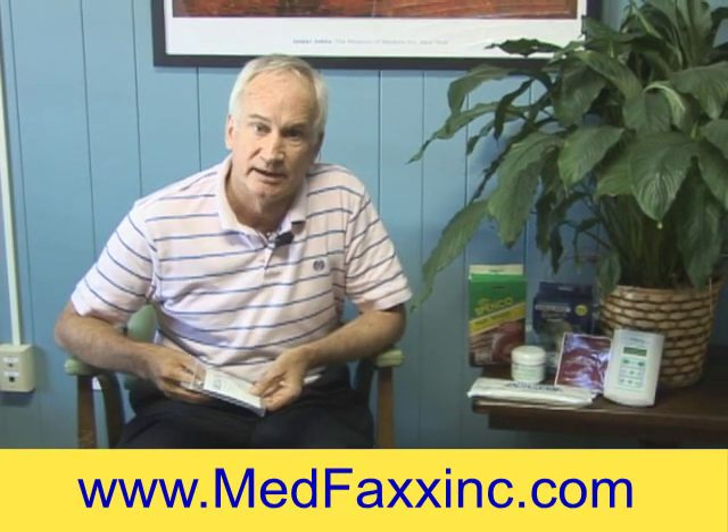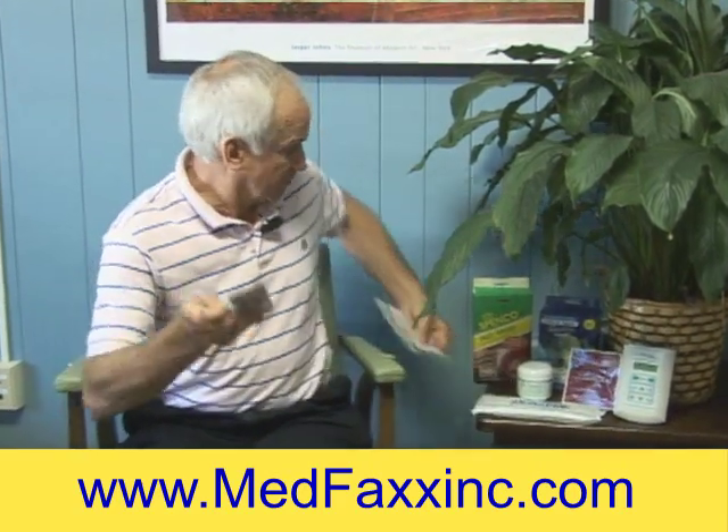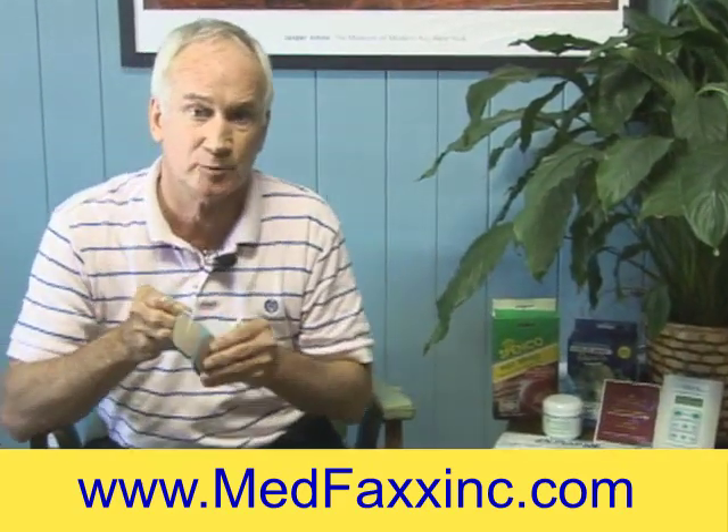Now I want to deal with your shoulder pain. Here's what we would do with shoulder pain — I'm going to take two electrodes. Presuming we're using a TENS unit, this is a 2x2. If we were using an interferential, we would use a 3-inch round or 3x3 electrode.